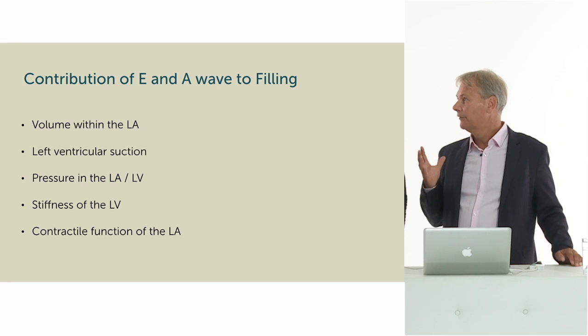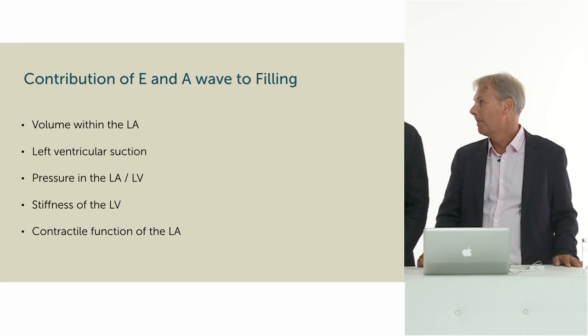Maybe, Martin, you can give us an example of where that might play a role? For example, in atrial fibrillation. The left atrium isn't contracting anymore. And maybe that's part of the reason why the patient has dyspnea, because he's losing the contraction of the left atrium. Therefore, there's no A wave, as everybody knows. And therefore, E over E prime, as I mentioned, is the only robust parameter.